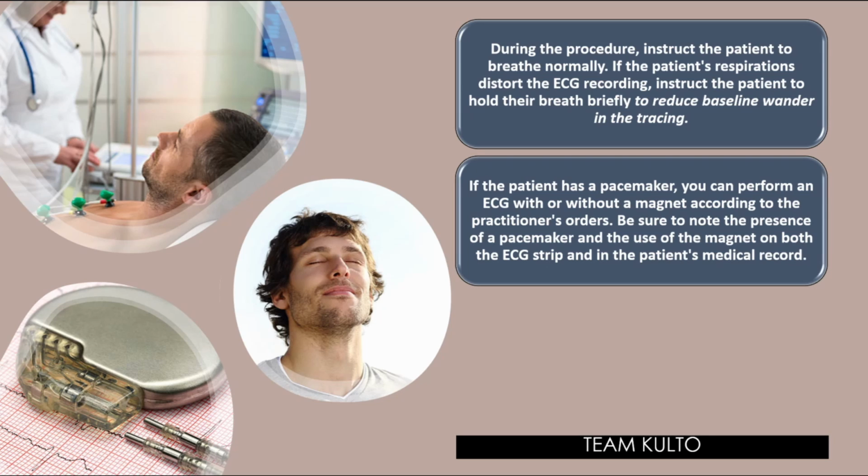Be sure to note the presence of a pacemaker and the use of magnets on both the ECG strip and in the patient's medical record. Naalala mo kapag nag-i-instruct ka or bago ka magawa ng ECG, ina-ask mo yung pasyente mo to remove belts or to remove jewelries or rings or coins, kasi it can actually alter the result of your ECG, can produce artifacts.